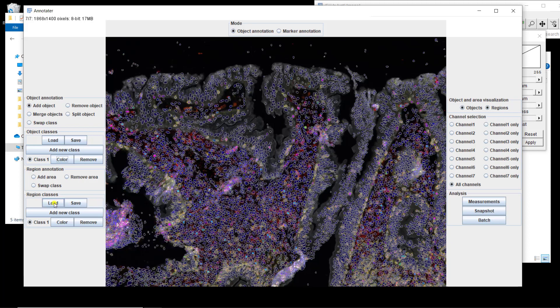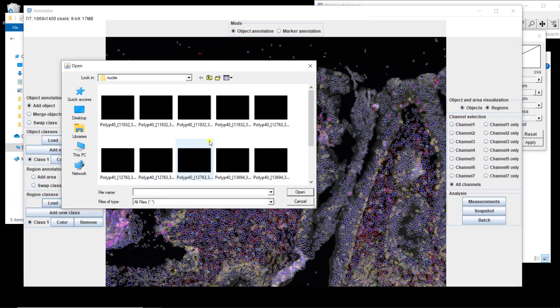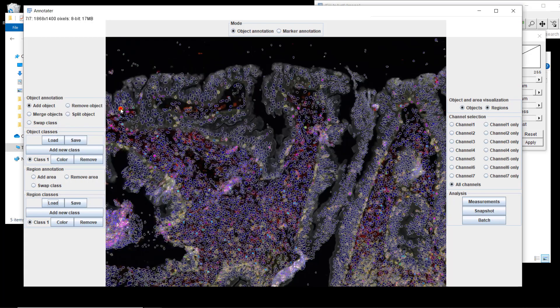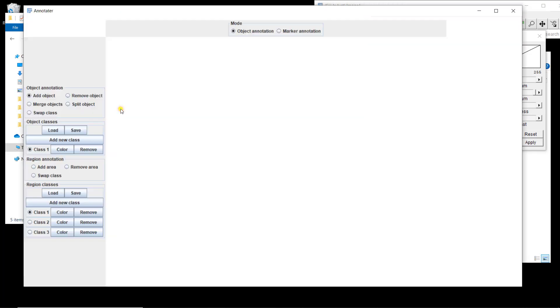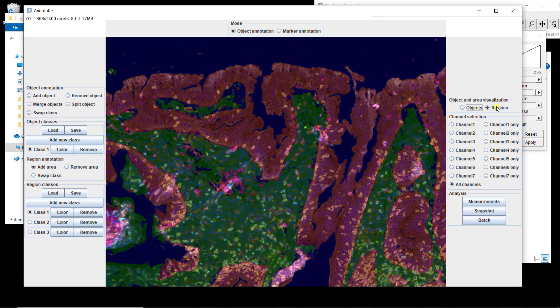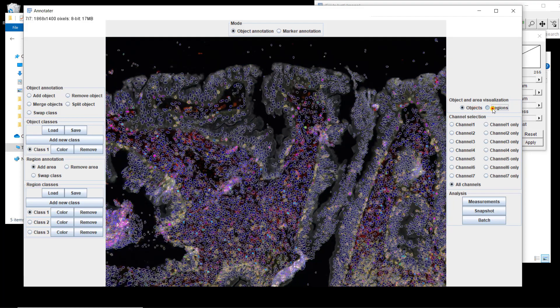I'm going to also load the region — so epithelium and stroma. If I go to the region classes panel, bottom left, hit 'Load', and select the corresponding segmentation we got with U-Net. So that's what we have. We can remove the regions, put them back, remove the nuclear segmentation, remove everything, put back segmentation, et cetera.